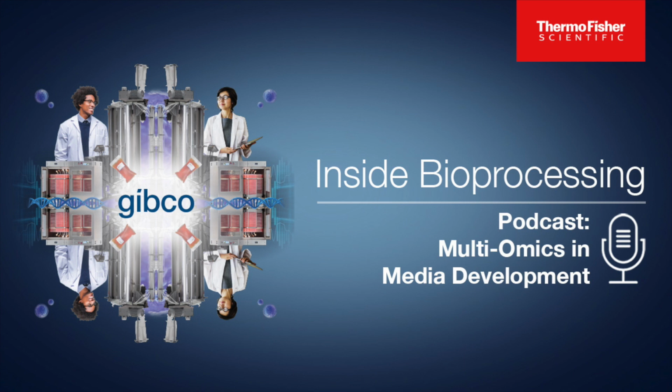And that always brings a certain amount of risk, particularly to the final product. It also makes downstream purification of those things very difficult. So, about the 90s, we started to want to remove these hydrolysates, start to be able to bring in chemically defined formulations. One of our earliest chemically defined formulations, CD CHO, was an immediate hit because so many groups were looking to remove those materials from it. And so that's where spent media work started.